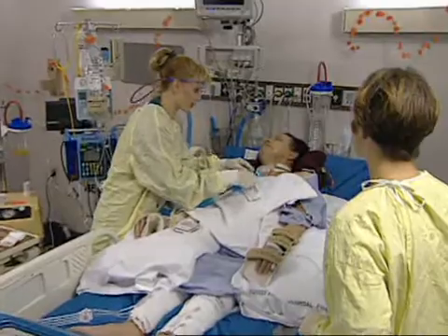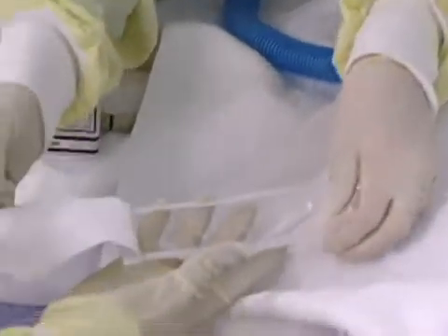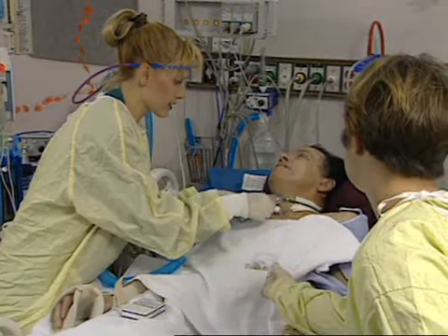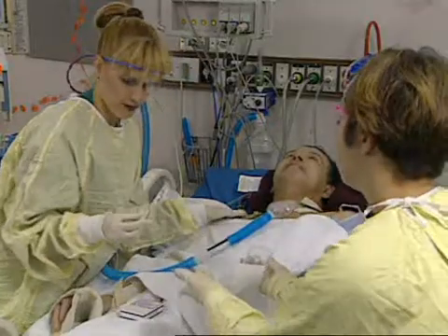disposable inner cannula Portex. And this is a sterile procedure, Jenny, so what we want to do, you hold that for me, thank you. He can breathe when I take this out. What the inner cannula does, it helps to minimize occlusion of the trach. Okay? And I know it makes you cough. I'm sorry, Mr. Gonzalez.